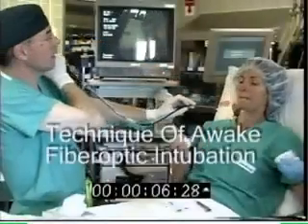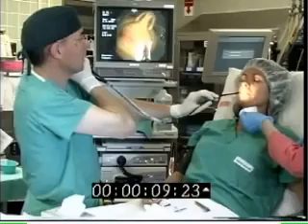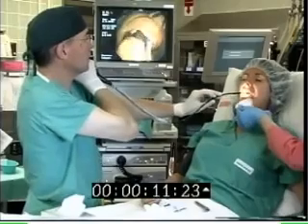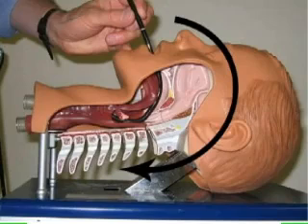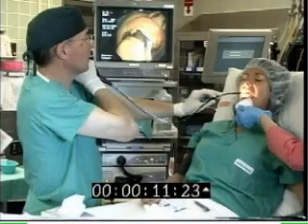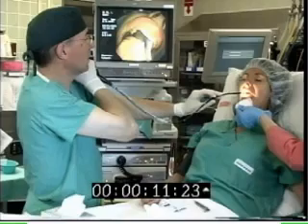The patient is placed in a semi-sitting position. Extension at the atlanto-occipital joint moves the epiglottis anteriorly away from the posterior pharyngeal wall and facilitates passage of the bronchoscope through the pharynx. It is our preference to perform the intubation facing the patient, as standing at the patient's right side facilitates negotiation of the natural C-shaped curve of the airway with the scope, permits easy visualization of the patient monitors, and maintains eye contact with the patient.